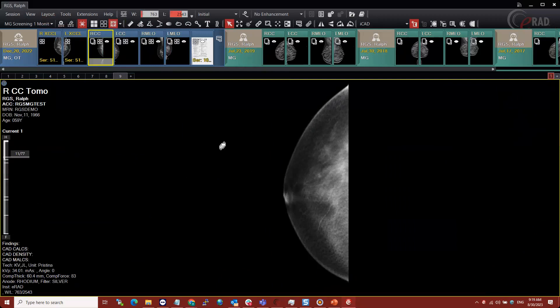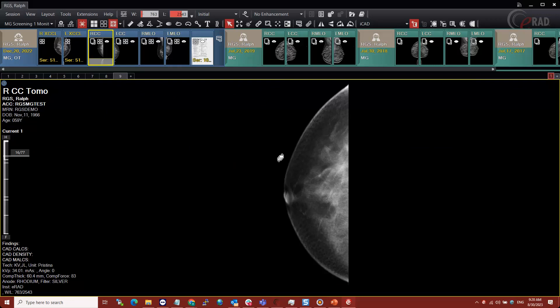That's a quick overview of hanging protocols. There's a lot more you can do with these — perhaps we'll do a more advanced session later. Or you can always schedule a time with an ERAD application specialist to go over hanging protocols in more detail. With that, I'm going to stop the video.